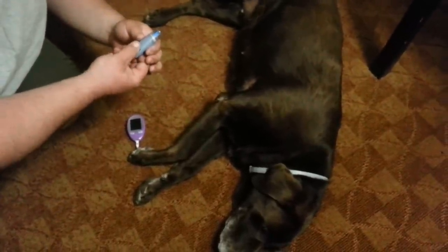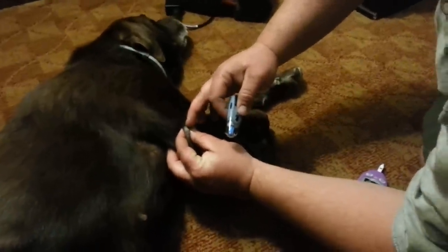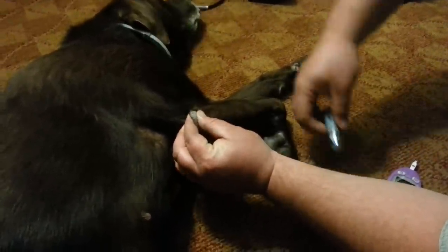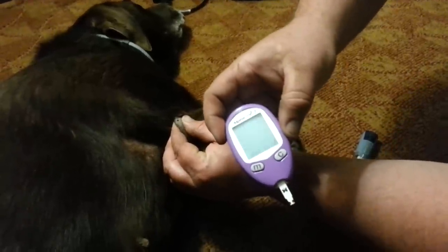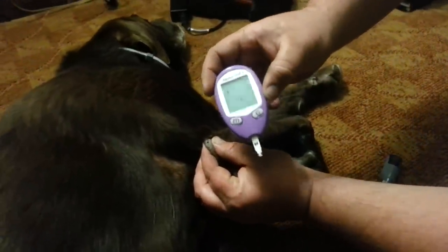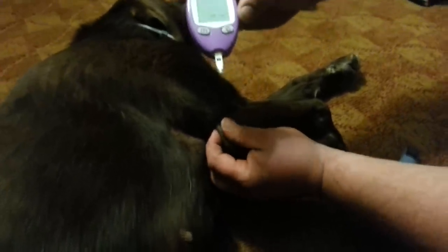Now this is cocked back. What I'm going to do is grab the upper part of this pad right here, put the lancet up there and push the button. You'll see there's already a drop of blood there. I usually just bump the meter against my arm to get it to come on. It's going to show you that code — make sure the code is the proper code, then it's going to go to the flashing. Now put the littlest dab right on the black dots here and it's going to beep. Once it's done, you can put your thumb over that, or wipe it away. Always tell her good girl.